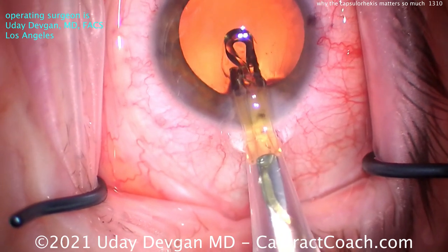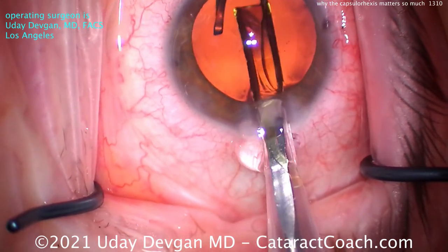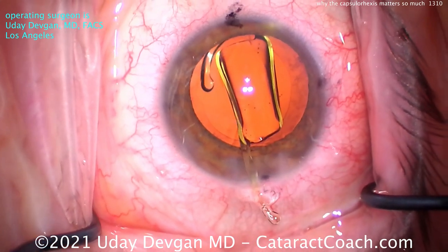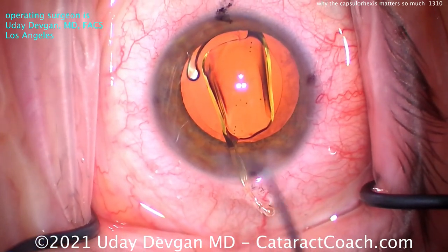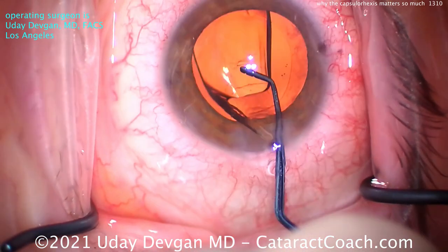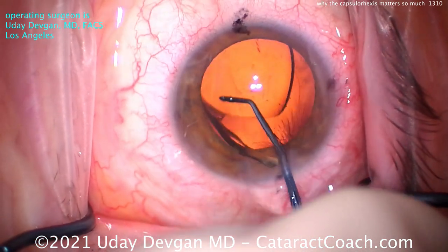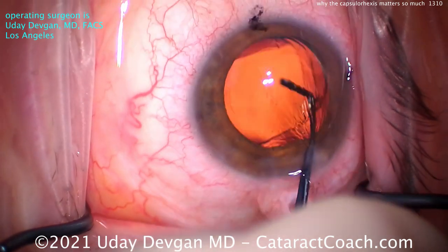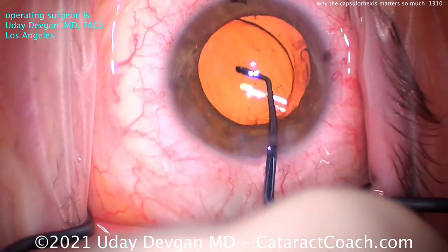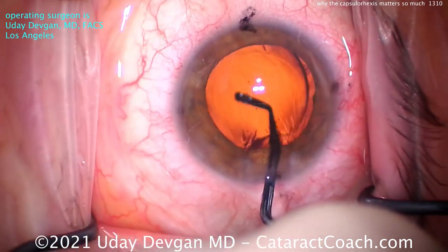So here comes our toric lens — let's deliver that. It looks like it's going in okay. Not the best loading there by the technician, but we can make that work. So there's the toric lens. You see the toric marks at the haptic-optic junction — those three dots on either side. Let's get this lens positioned where we want it, making sure it gets completely in the capsular bag. And you can see on the cornea there are some marks that indicate the correct meridian.